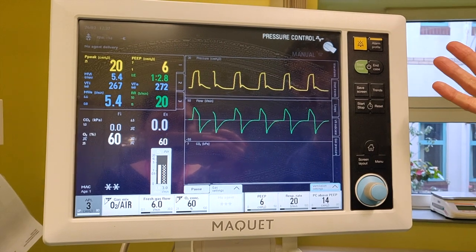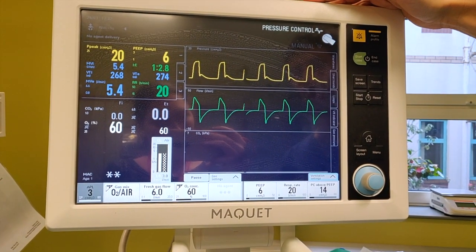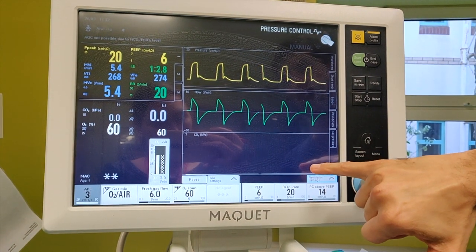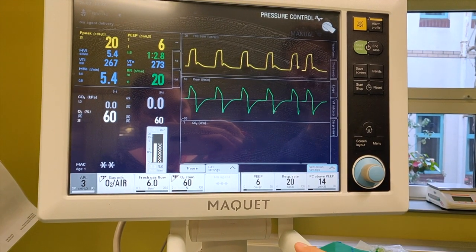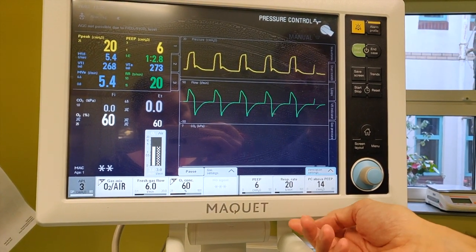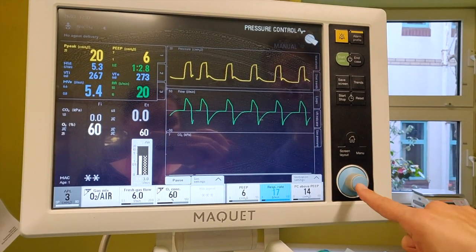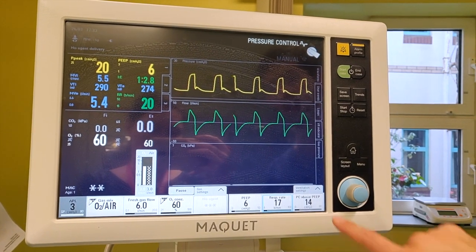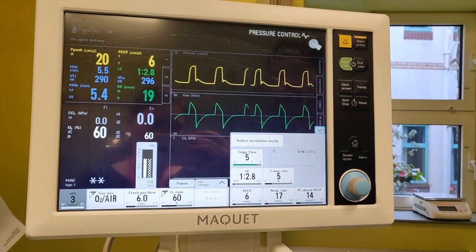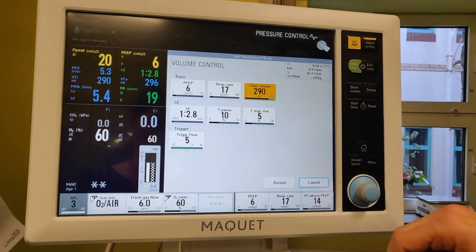So we're ventilating away. You've got the waveforms that look very similar to what we've got on the unit. Down here would be your end tidal CO2 waveform. If you want to change things, it's very similar to vents on the unit, except you've got none of the knobs on the bottom. Respiratory rate — I want to push it down, just tweak it down, confirm. Equally, you can bring up all the ventilation settings by pressing vent settings and get the rest of them. You can go back into the mode and click across — I've got a bit of volume control now.